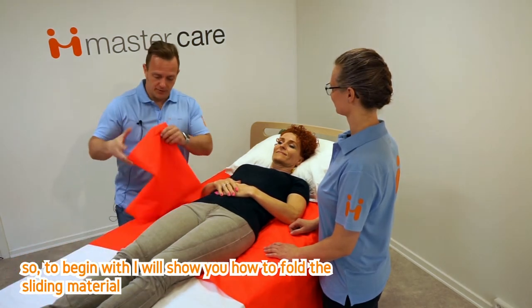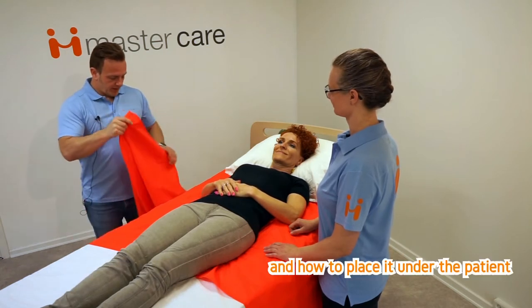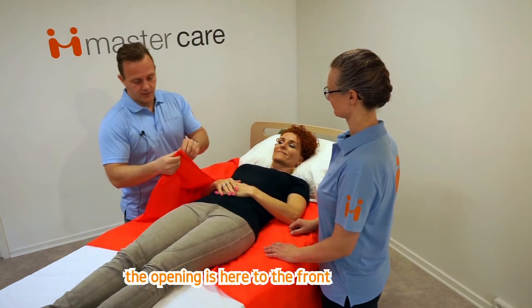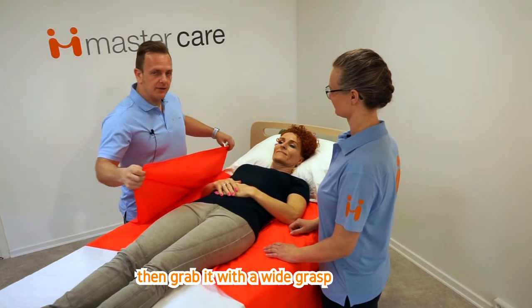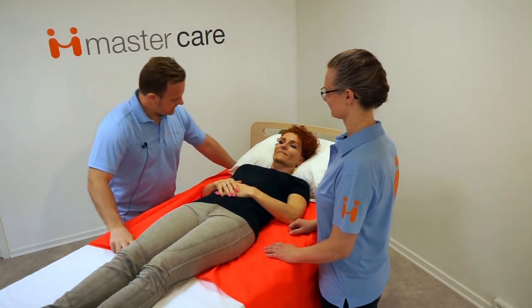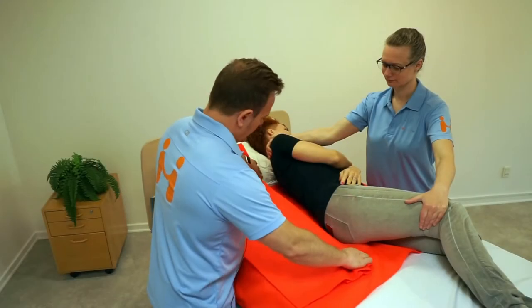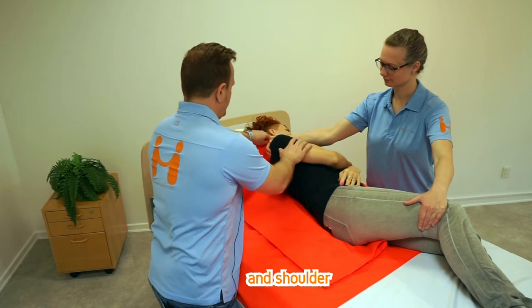To begin with, I'll show you how to fold the sliding material and how to place it under the patient. The opening is here to the front — then grab it with a wide grasp. This way the helper on the opposite side can easily pull it out. Fold it two times and tilt the patient to the side and place the sliding material under the hip area and shoulder.